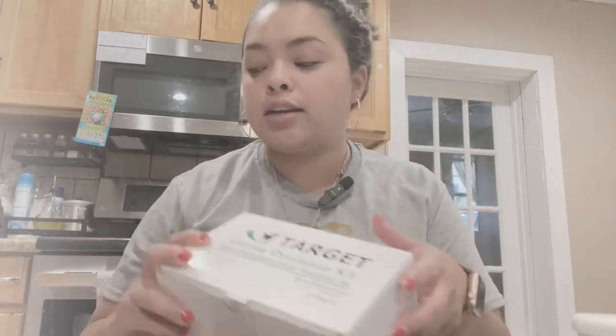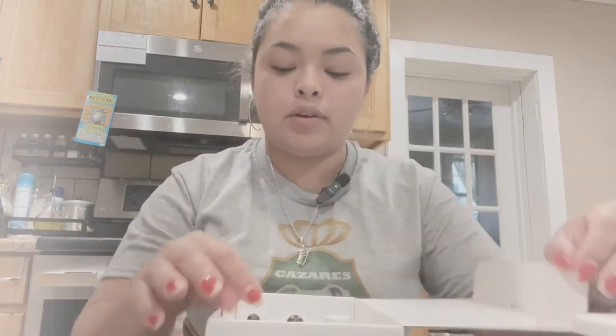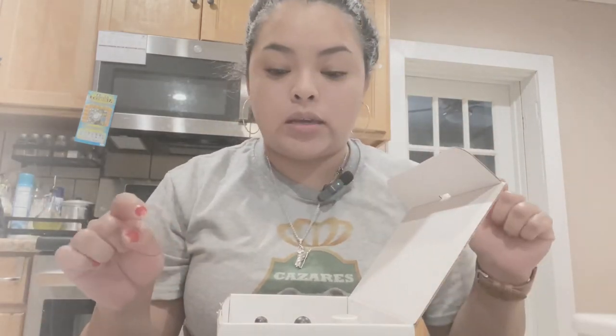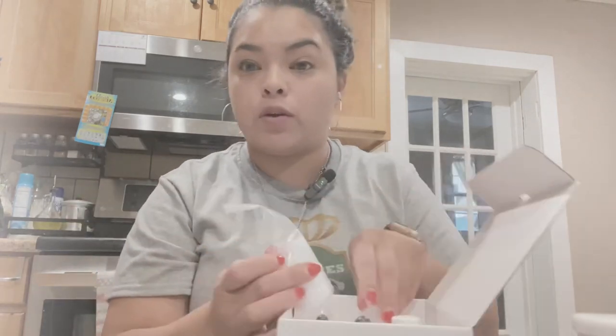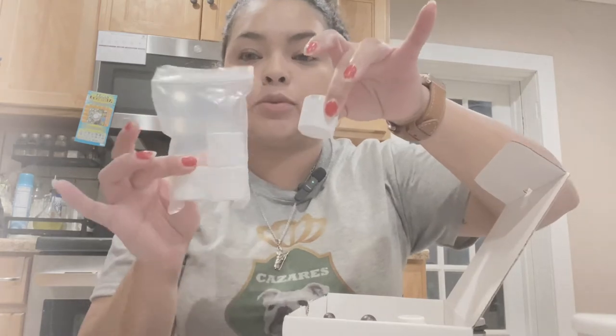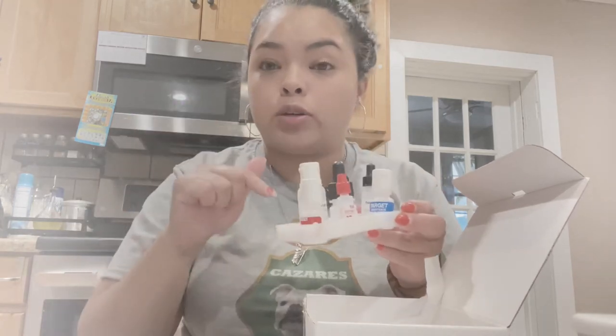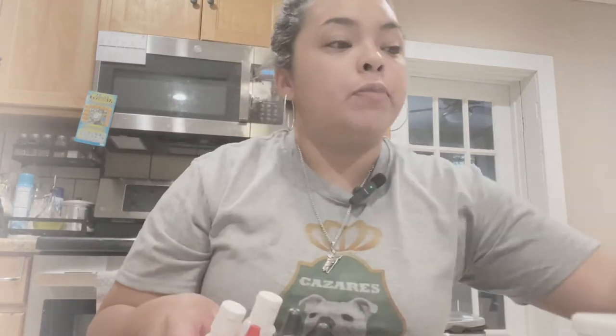Hi everyone, Anai with Casas Royal Lineage Bulldogs. In this video I'm going to show you how we do our progesterone testing for our Bulldog females. We use this kit — it's the Target Canine Ovulation Kit. It comes with some pipettes, this is a kit of 12 pieces. It also comes with cups for your testing and all the liquid formulas you need.